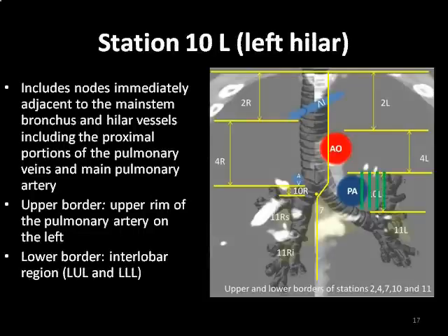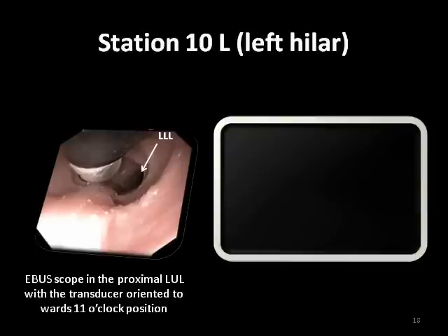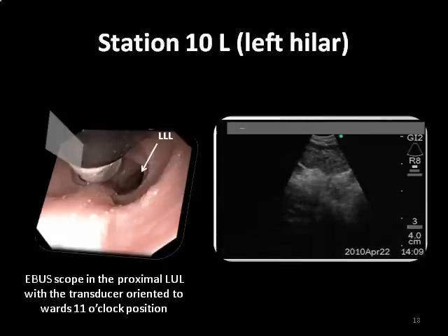Station 10L is immediately adjacent to the left main bronchus and hilar vessels, including the proximal portions of the pulmonary veins and main pulmonary artery. The upper border is the upper margin of the left pulmonary artery, and the lower border is the interlobar region between the left upper and lower lobes. To visualize hilar Station 10L, the EBUS scope is placed in the proximal left upper lobe bronchus, with the tip pressed to the bronchial wall towards the 11 o'clock position. A conglomerate of two nodes is seen in front of the left pulmonary artery located near the 7 o'clock position.